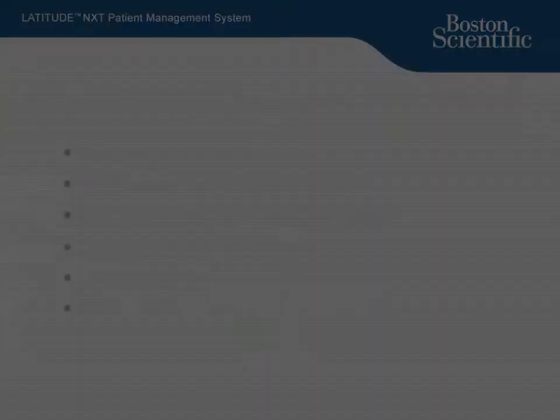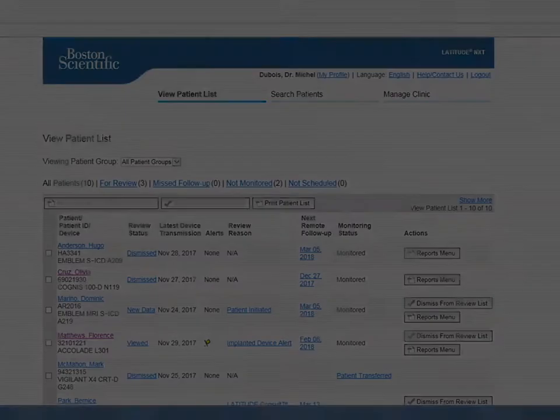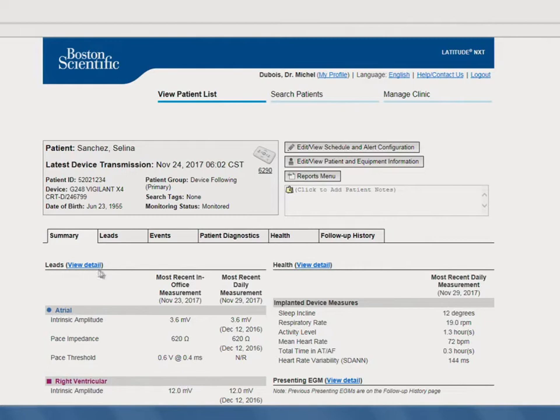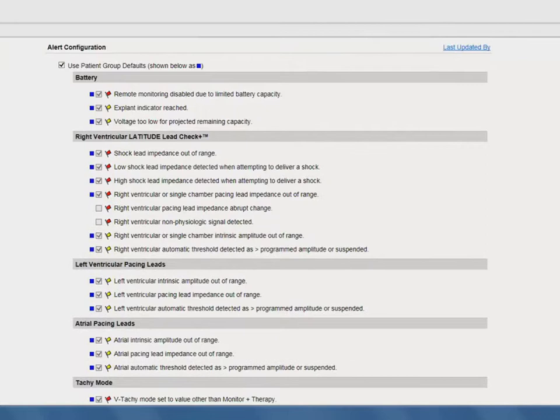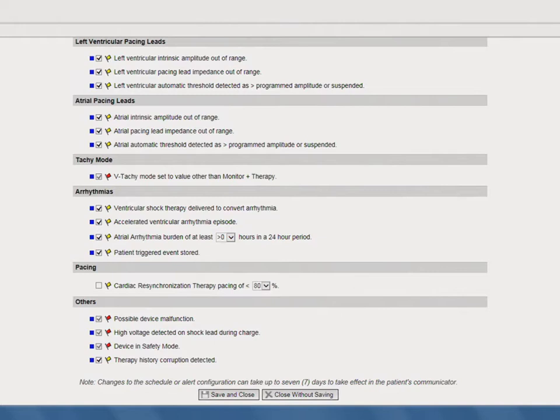Next, we'll demonstrate configuring alerts for individual patients. Locate the patient whose alerts you want to individually configure. Click on Edit View Schedule and Alert Configuration. On this page, scroll to Alert Configuration and deselect the Use Patient Group Defaults checkbox. This is important because when this box is checked, you are prevented from individually configuring the patient's alerts. Now review the alerts and ensure the checkboxes are selected for each alert you want to be notified of, and select the limit of the applicable yellow alerts. Once you've completed your alert selections and configurations for this specific patient, scroll down and click Save and Close.